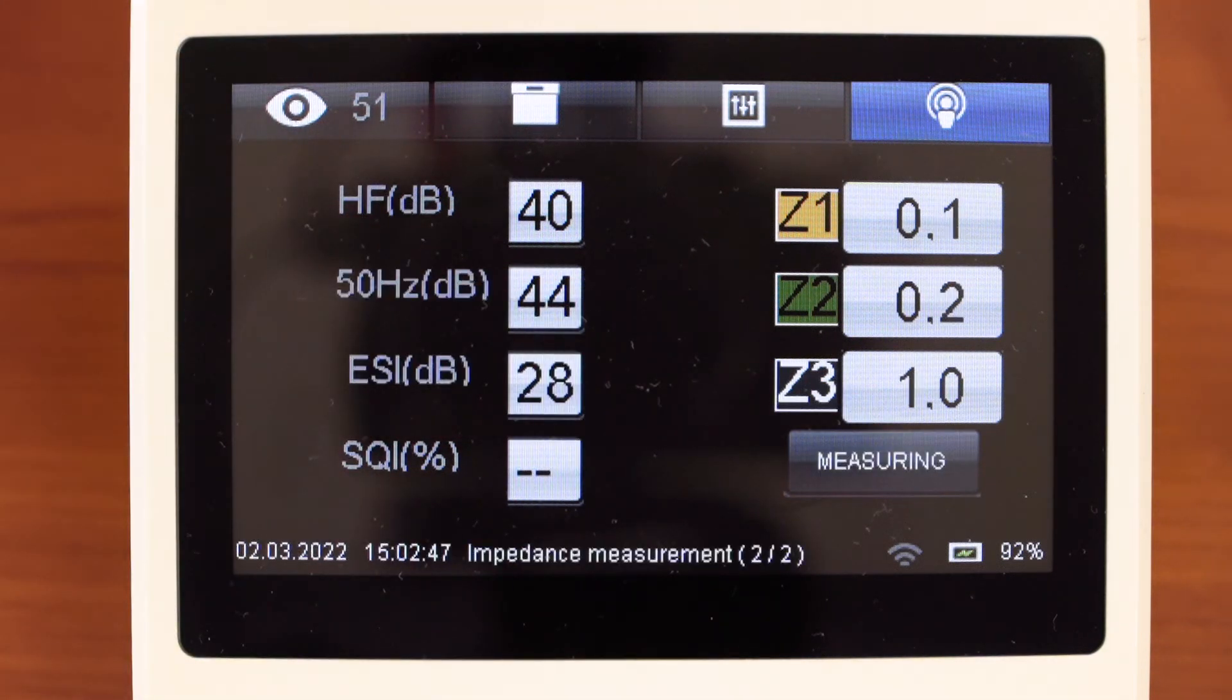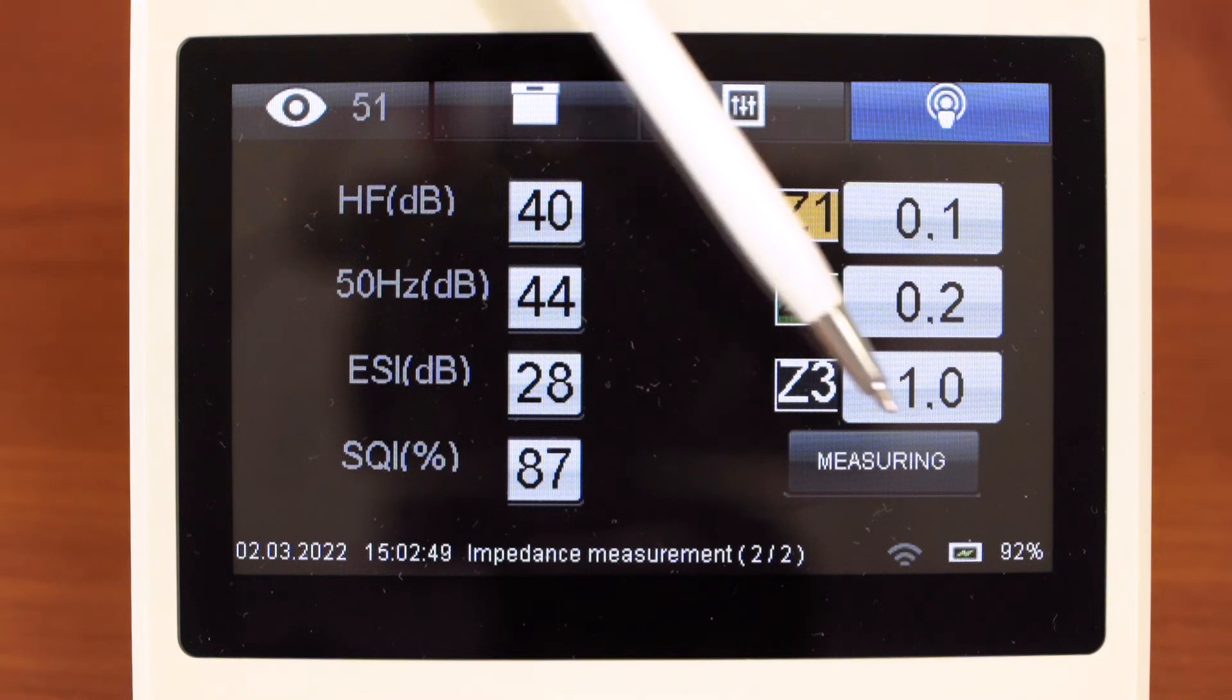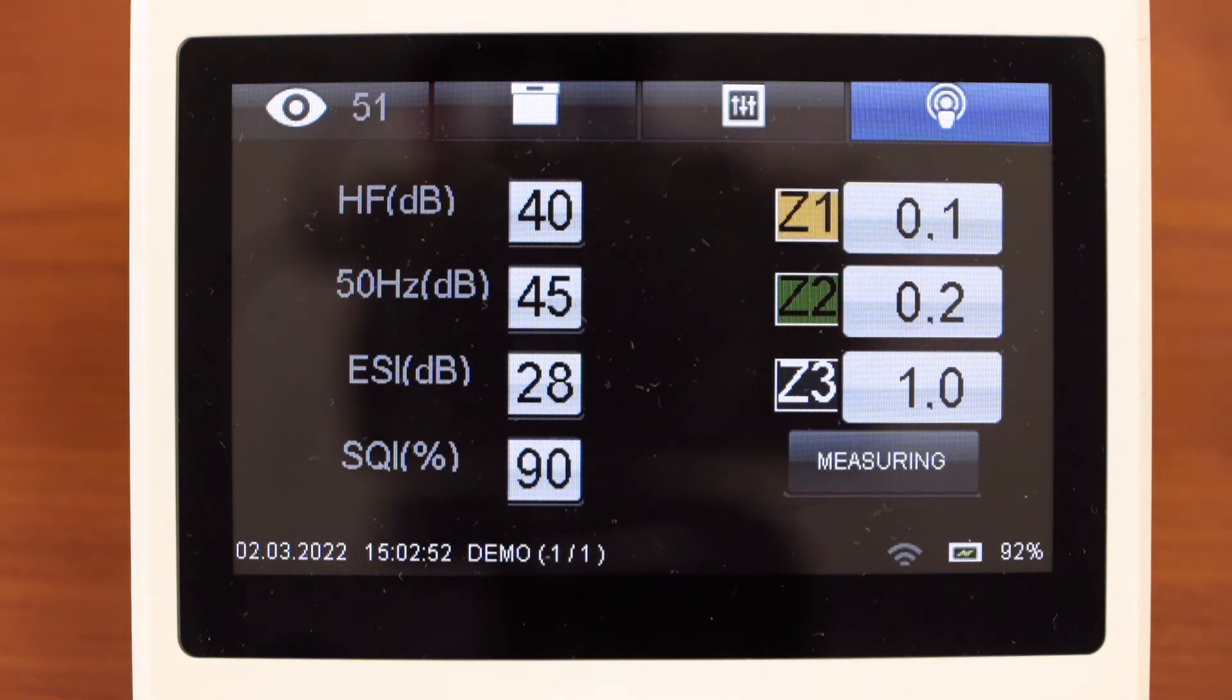You can see electrode impedance in kilo ohms. Normal impedance value is below 25 kilo ohms.